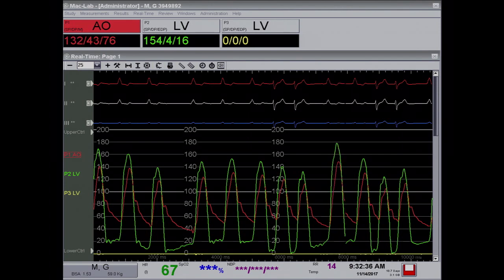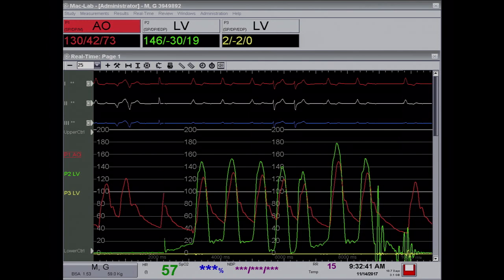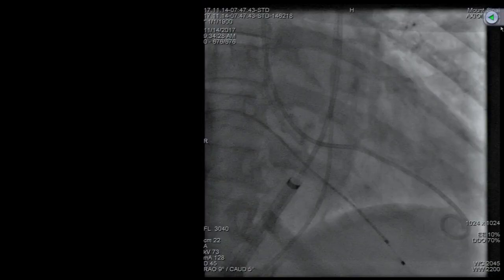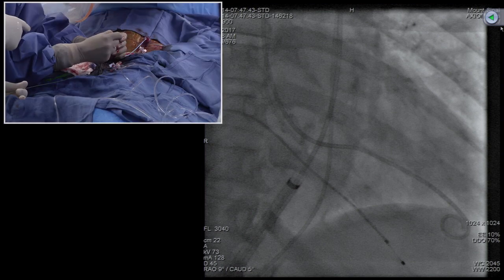Okay. So you see the hemodynamics, the patient does have aortic stenosis even on our hemo. So initially, I think when you were talking on the fluoro screen on the side, you saw that I had to do some manipulation of the AR2. To cross a valve, we use AR2 and then the straight glide wire, which was easy to cross, but then the AR2 was probably under some kind of a papillary muscle, so we had to get the pigtail. Now the pigtail is in the apex, so we had to do that with the pigtail.